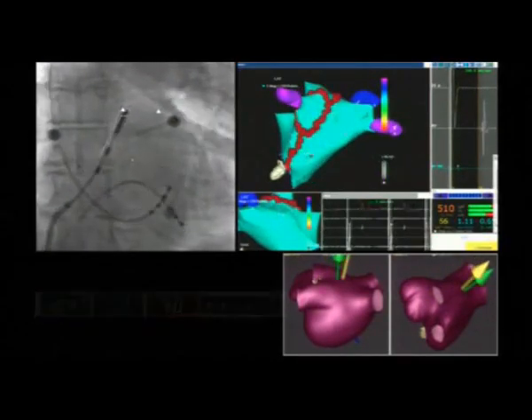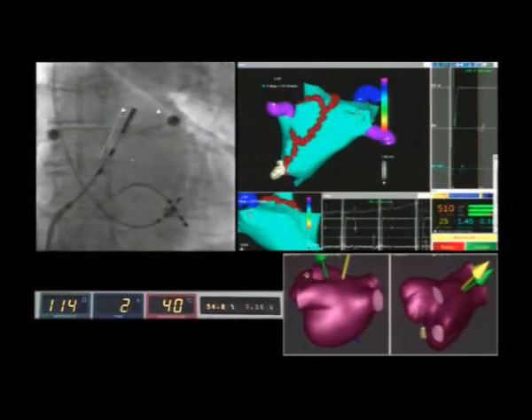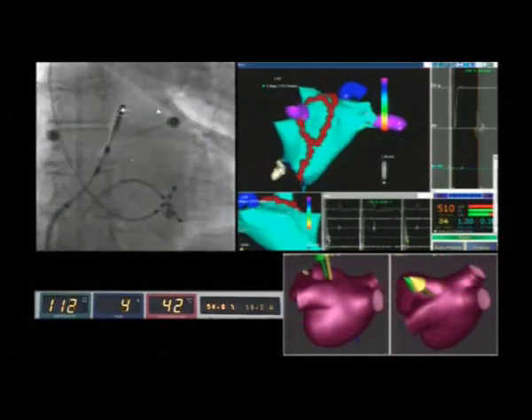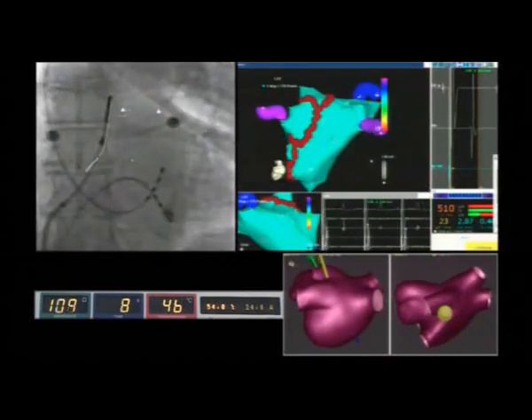The operator is now starting to perform the circling lesions around the right inferior pulmonary vein shown in violet. The right superior pulmonary vein is shown in blue.